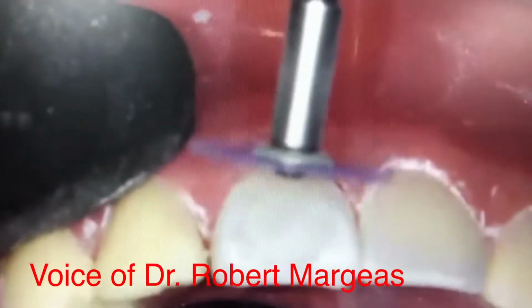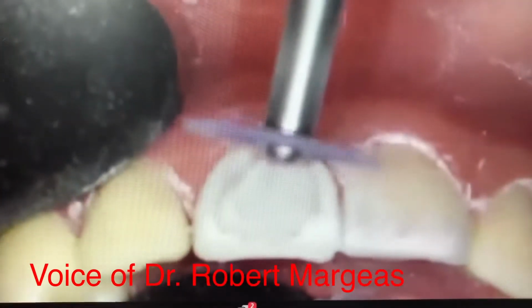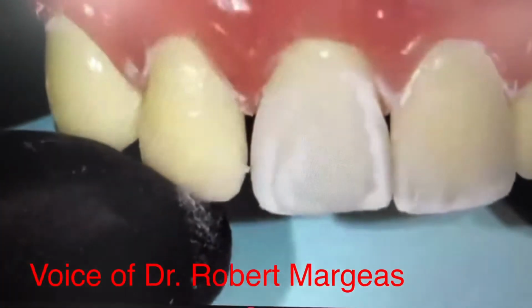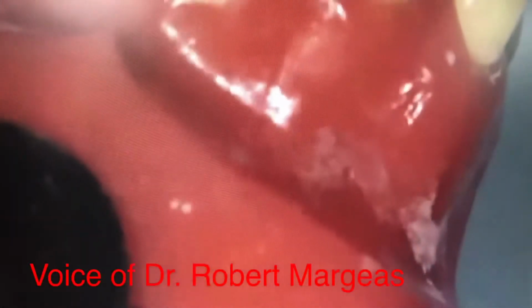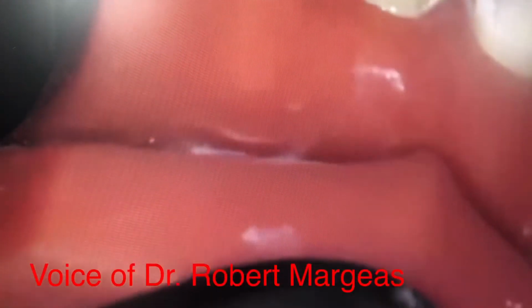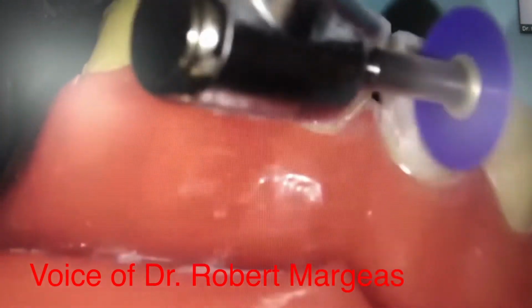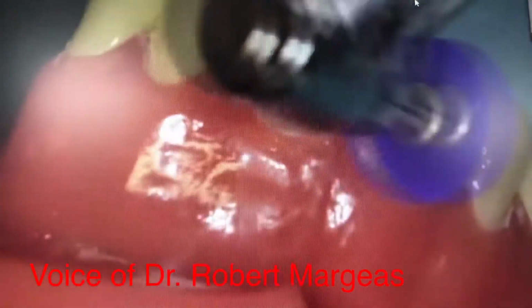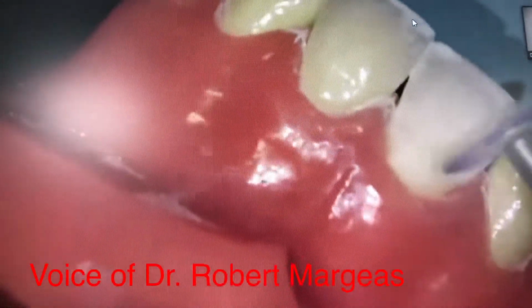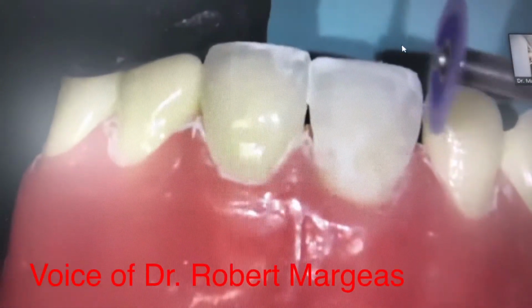I'm blending this in. Notice that I'm not taking the disc and just running it across the tooth from mesial to distal. I like to work between the line angles. Why? If you take this disc and go like this, your tooth's going to get too fat. I like to keep the disc into the interproximal and I move the line angle in like this. I don't want to necessarily go across the tooth just like that. I want to make sure that we have nice line angles.